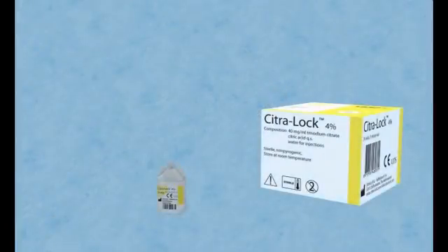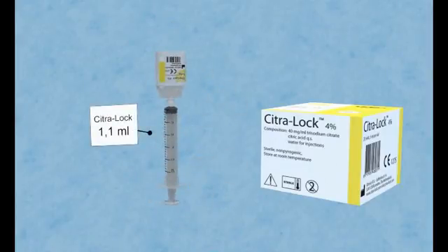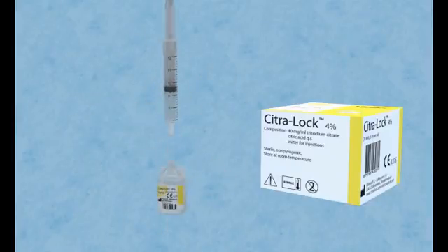Instill the CitroLock. Take the empty 2.5ml syringes and fill these with the precise volume of CitroLock as indicated on the catheter.